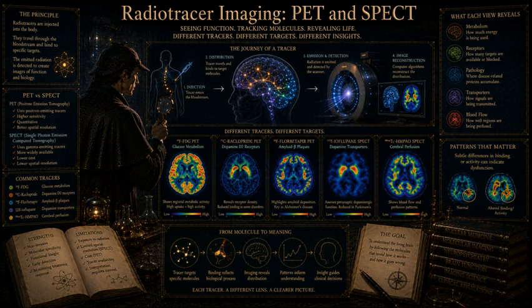Question 6, clinical reasoning. In TSPO imaging for neuroinflammation, why is mandatory genetic pre-screening required for second-generation tracers like 11C-PBR28? Think about the patient variables and the binding site lock. Changing locks. Yes, the answer is due to a specific single nucleotide polymorphism, rs6971. This genetic mutation physically alters the binding site of the protein, creating high, mixed, and low affinity binders in the general human population. If you do not genetically screen and statistically control for this, the vast variance in specific binding affinity wildly and completely skews any quantitative results comparing patient groups.